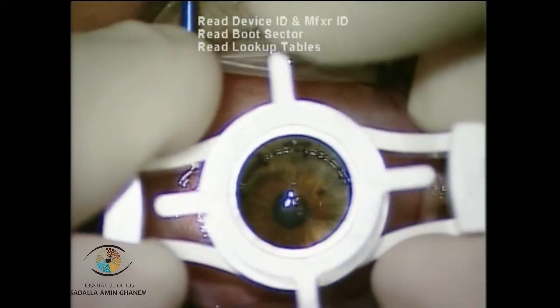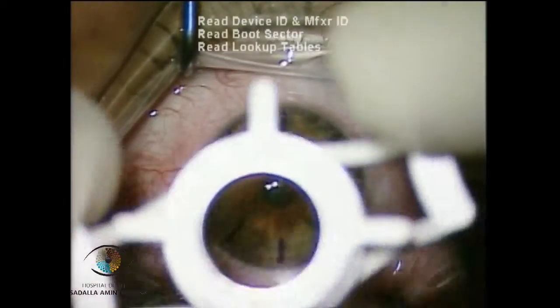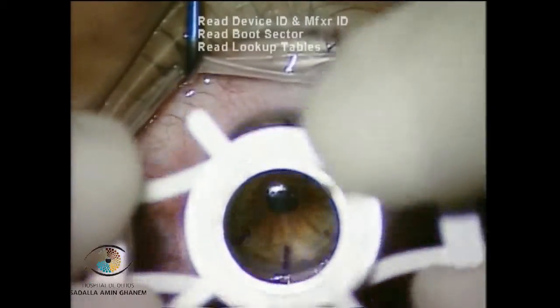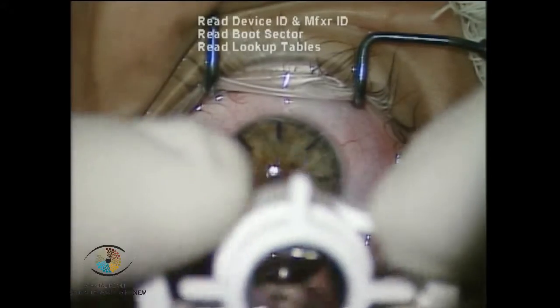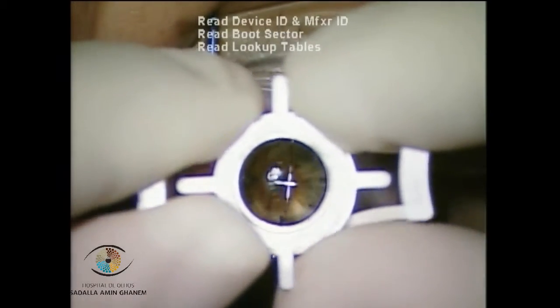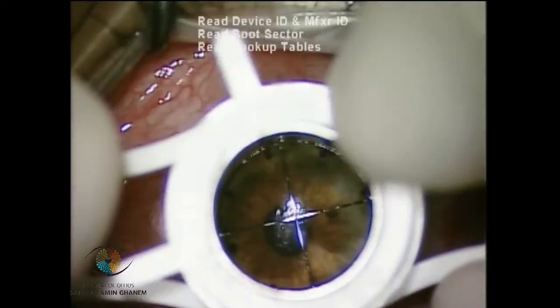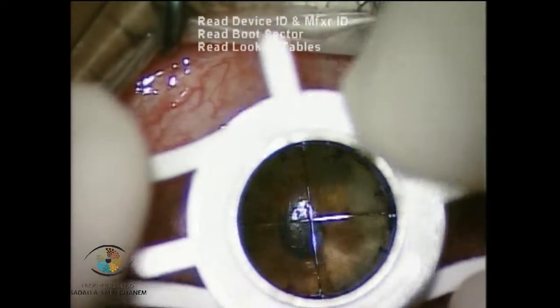As you can see, after a few attempts at trephination, my fellow lost count of the number of turns that should be performed to avoid perforating the cornea. Each complete turn on the Barron trephine gives 200 microns of trephination. So usually in DALK we perform 400 microns of trephination to avoid perforations, as you can see in this case.